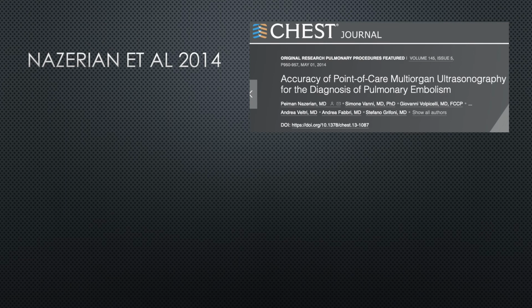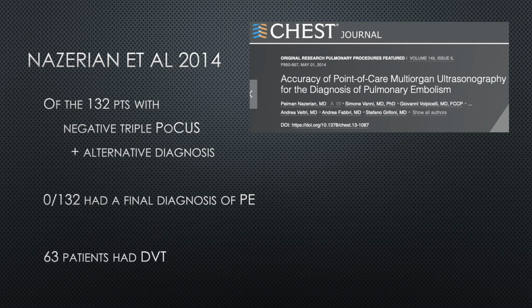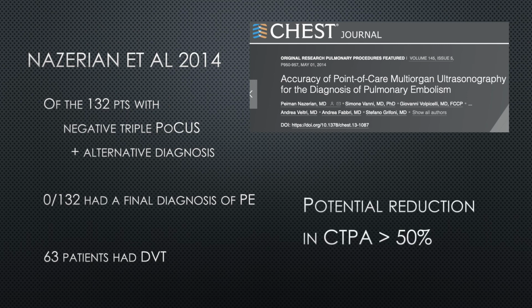So Nazarian also looked at the potential for reducing unnecessary CTPA. So in the 132 patients that had a negative triple PoCUS plus a clear alternative diagnosis, so for example pulmonary edema or lobar pneumonia, in none of these patients was there a final diagnosis of PE. Also, 63 patients had a positive DVT. So he argued that you can reduce CTPA use in both of these groups. In the first group, because you've got a clear alternative diagnosis, and in the second group, because you're going to anticoagulate anyway for their DVT. So he found that we can reduce our CTPA use by more than 50%.